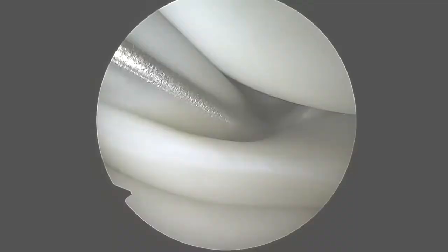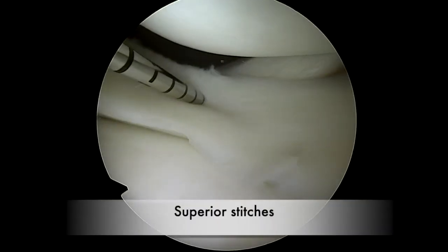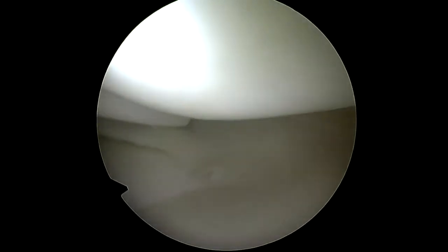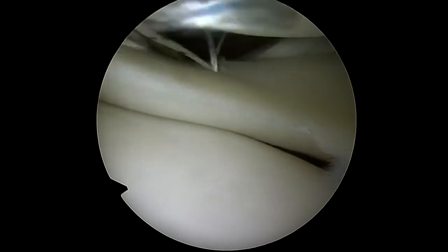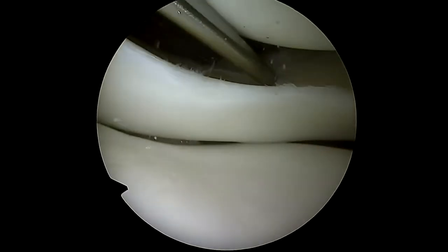Careful debridement of the tear is performed with a motorized shaver. Once the debridement has been completed, the first superior stitches are placed with meniscal suture anchors. The first anchor is placed through the meniscus while the second one is placed over the meniscus. In this area, anchors can be placed through the popliteus tendon without causing any particular post-operative discomfort.